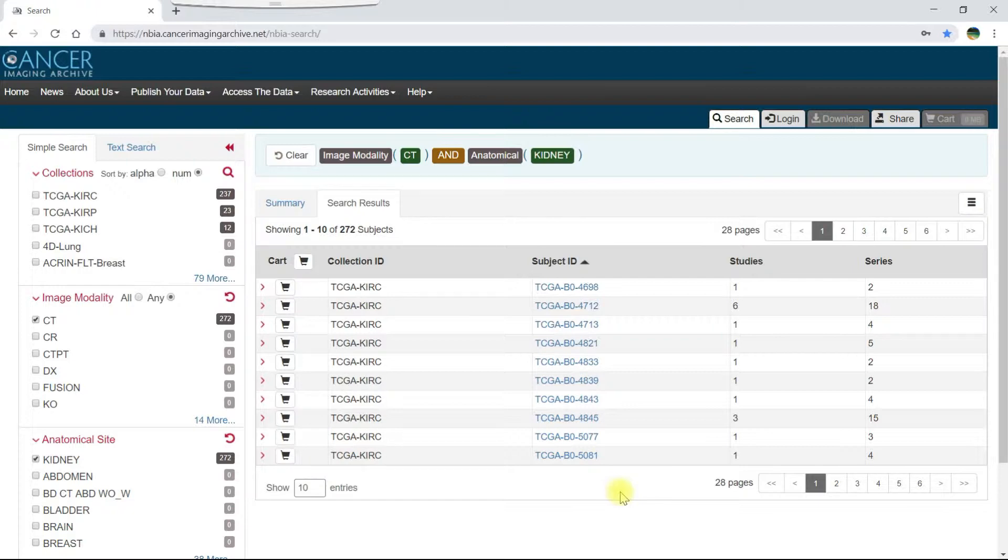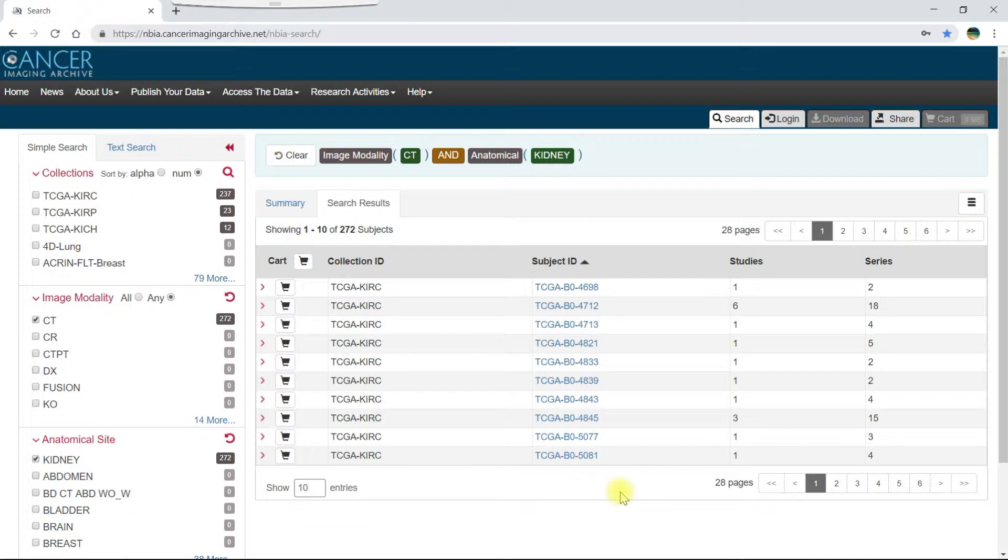I can click either the subject ID link or the arrow to the left of the cart icon to see all of the studies or time points for this subject. I can then drill down further to see the series or scans associated with an individual study or time point.